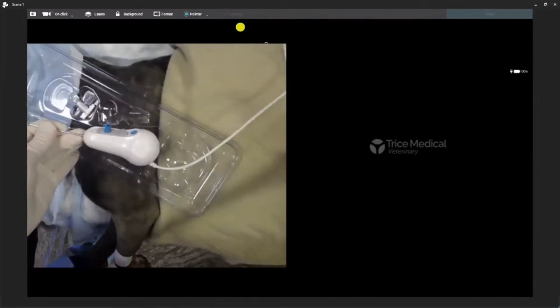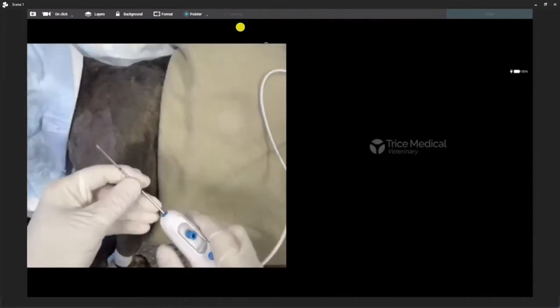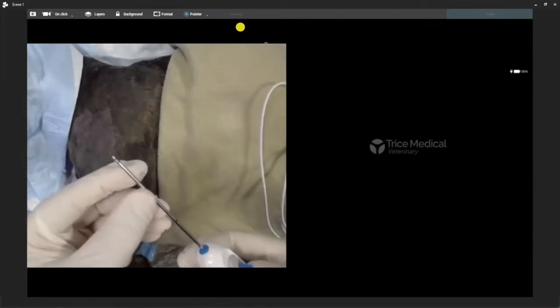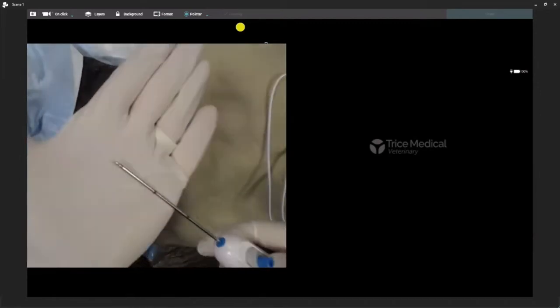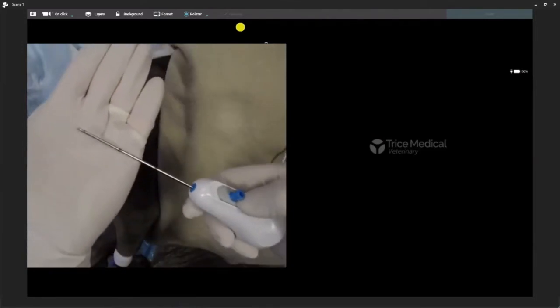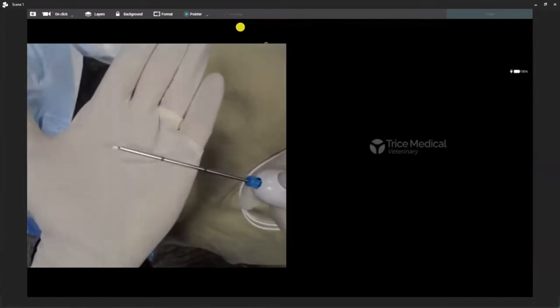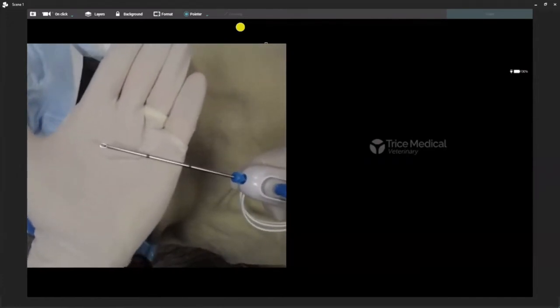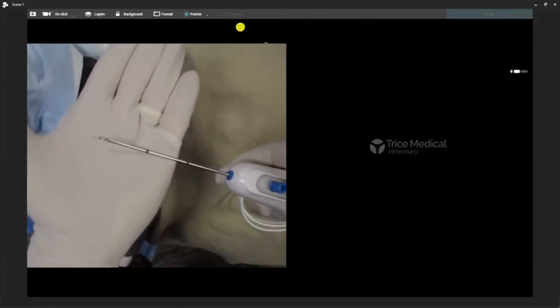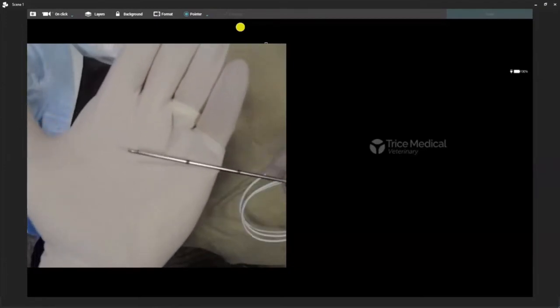As far as use: you can see there is a very fine tip here — there is a needle at the tip. When you push down and push out, you can see we have the needle itself just with the sheath. When you want to gain your optics, you just go ahead and snap this down, slide it back, and your optics are out.